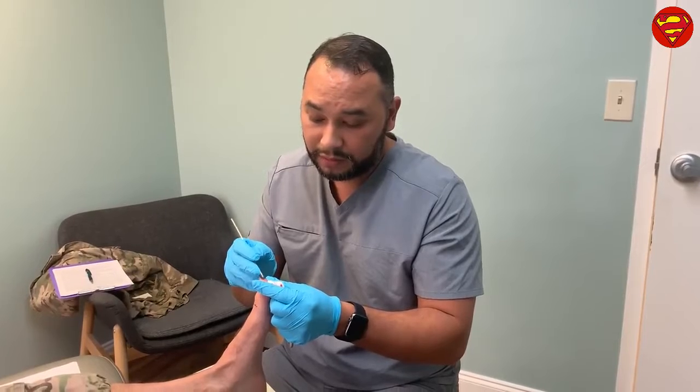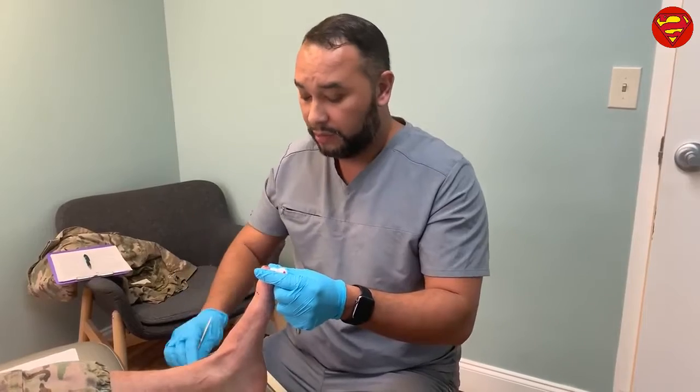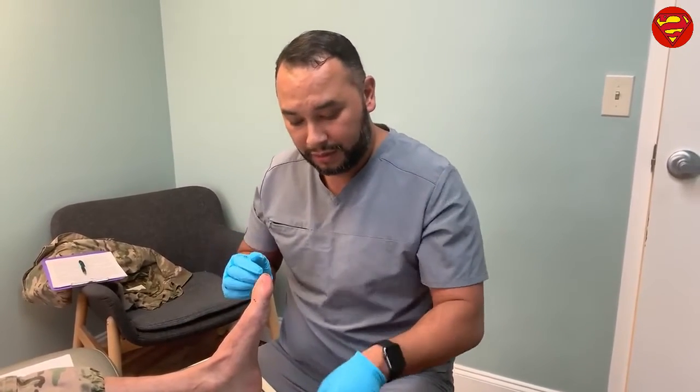So now we have it nice and cauterized with a little crater here. And I think we are done. So that wraps it up for our wart excision. Grace, I hope you enjoyed it. You didn't feel a thing, so we're all good.